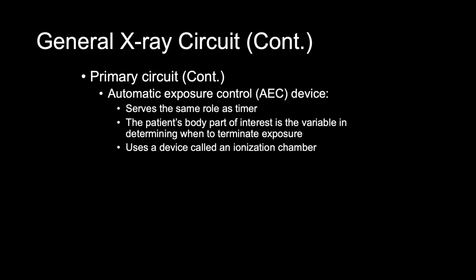Basically, just like the timer, we have the AEC device, which is the automatic exposure control. This device operates a little bit differently from others in that it uses the patient's body part of interest as the variable in determining when to terminate the exposure.